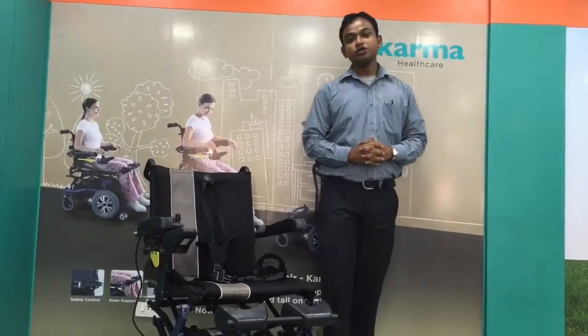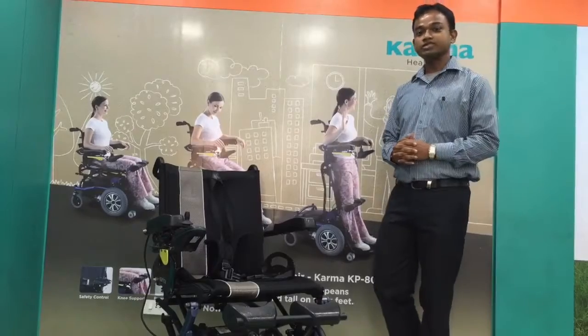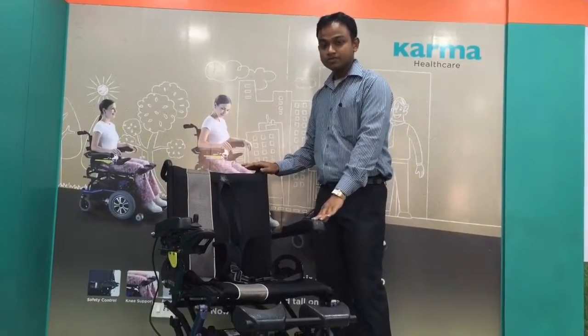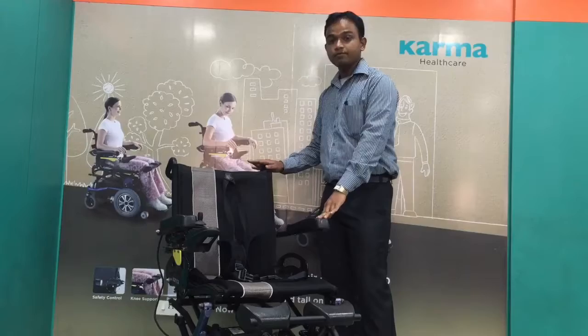Hi, my name is Avijit. Today I am showing you the Karma Ergonomic Power Standing Wheelchair called KP80. It comes in an SRBO series, and it's a motorized power-driven standing power wheelchair.